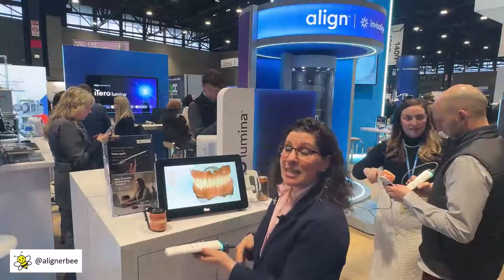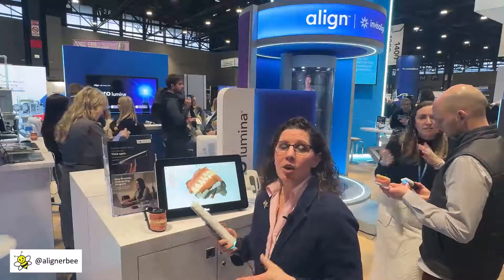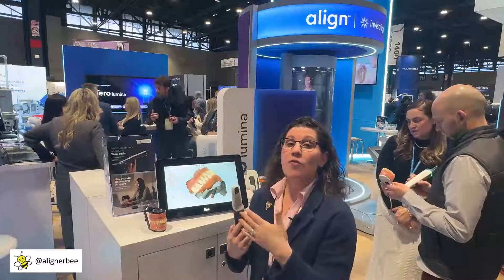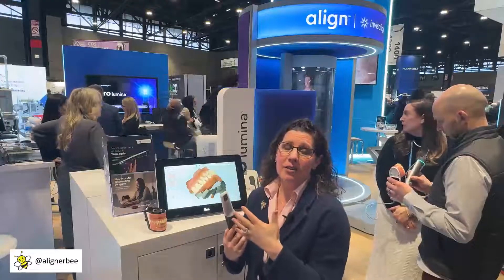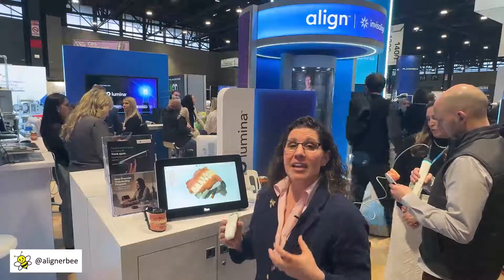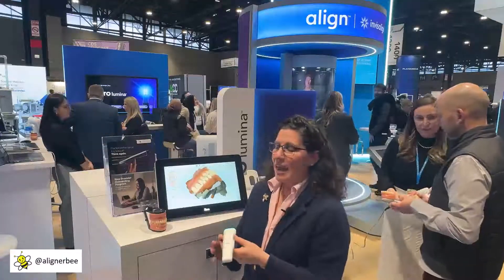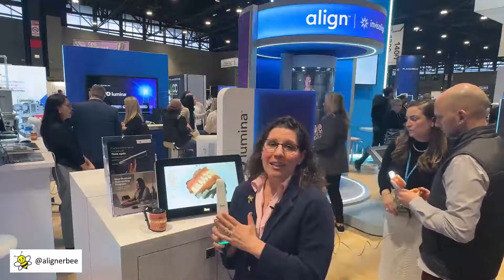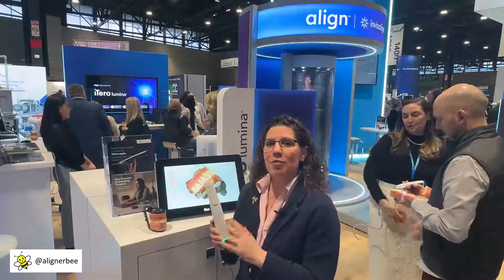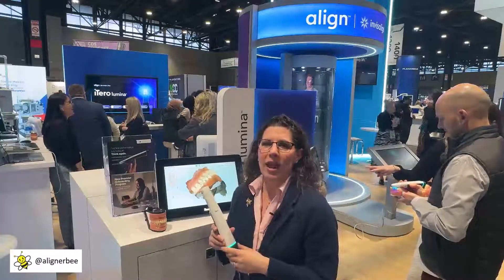I was able to scan the upper arch and the lower arch in under two minutes — a great new innovation. iTero has brought us a new form of scanning utilizing six cameras, moving away from the previous confocal technology. This is going to allow for fast intraoral scanning in the clear aligner and orthodontic space. Currently, this is approved for use for orthodontic treatment and clear aligners, and hasn't yet moved into the restorative and general dental space, so it controls one aspect of the practice.